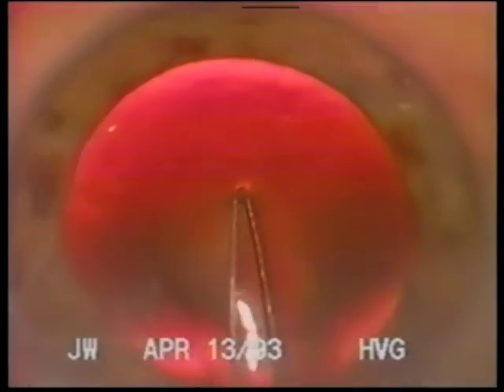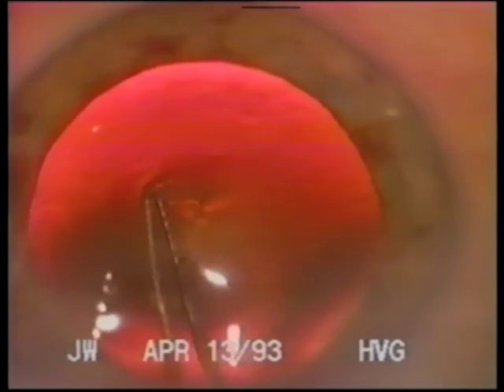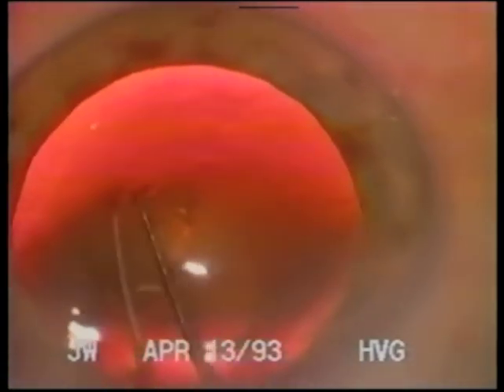I use a pointed capsule forceps to puncture, grasp, and initiate the capsulorhexis tear all in one motion. The capsule is re-grasped only when necessary to control the tear.